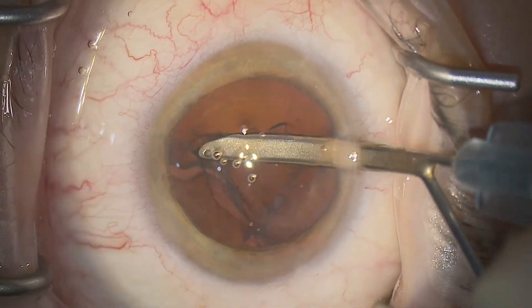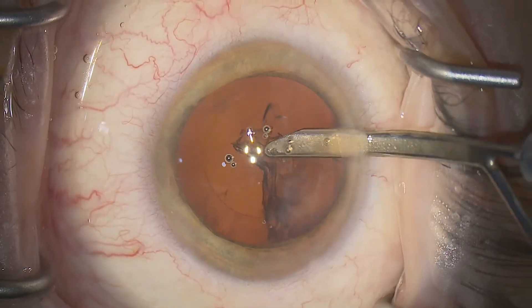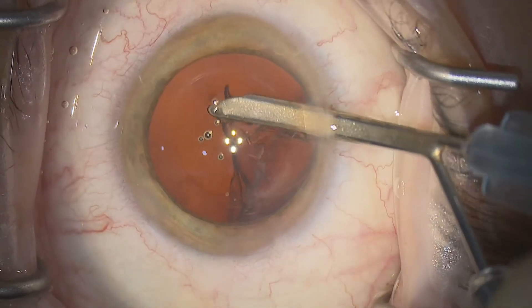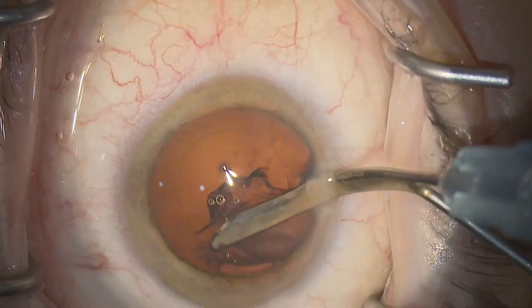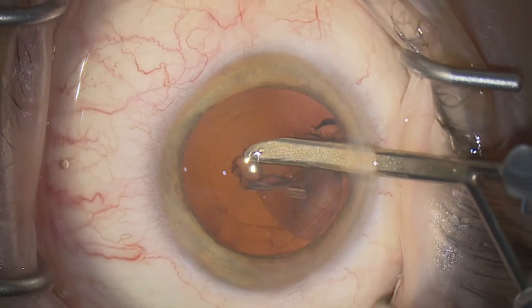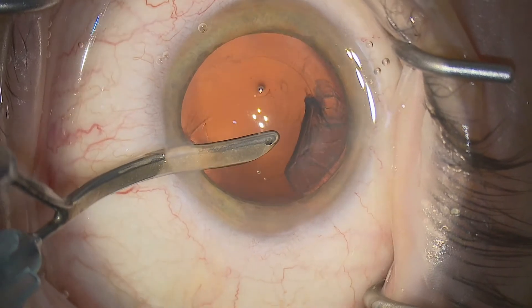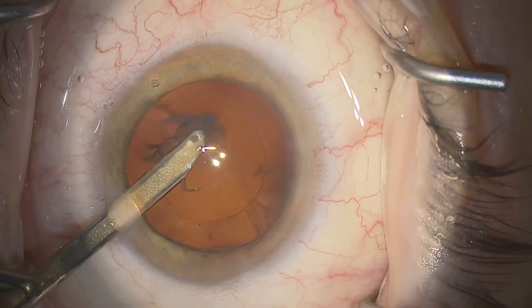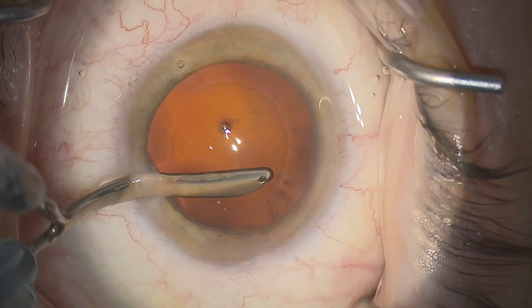Again, you're sweeping in the periphery, engaging underneath the anterior capsule, stripping into the center, and then aspirating. And then once again reaching under the anterior capsule, stripping into the center and aspirating. Coming in from the other side — here you can see what happens if you grasp the cortex over the posterior capsule rather than on the anterior capsule: it tends to strip away less cleanly, leaving a lot of stringy cortex in the periphery.